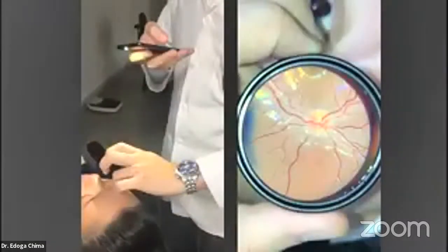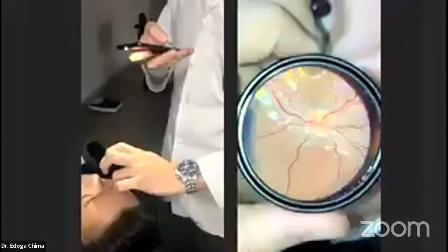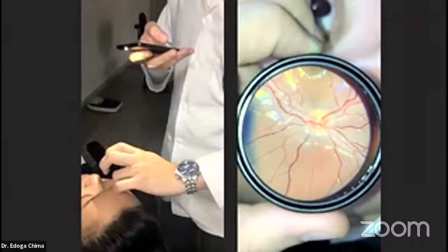So in this clip of the video, you notice the difference between the phone and smartphone ophthalmoscopy, fundoscopy, or smartphone retina photography or fundus photography.